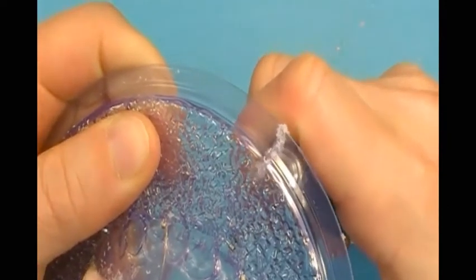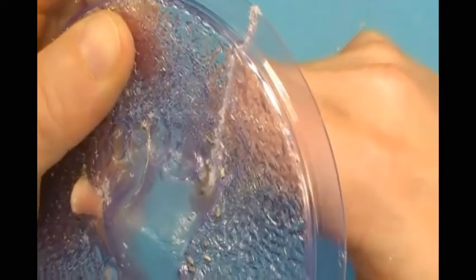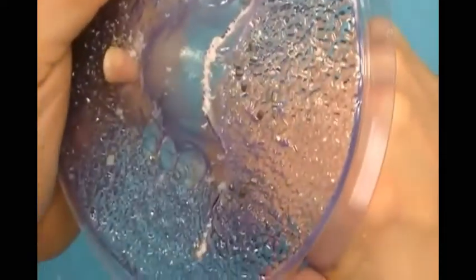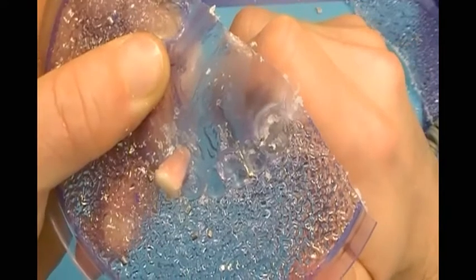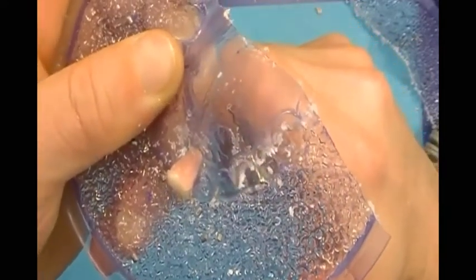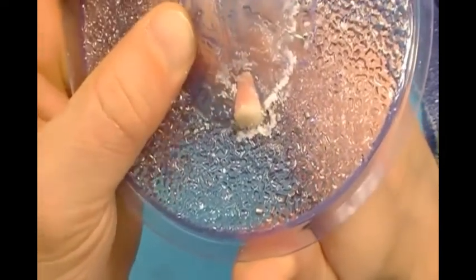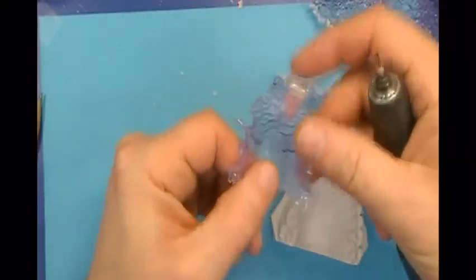Using a carbide cutting bur and lab handpiece, cut out the retainer from the disc. Start by cutting along the back of the appliance at the first or second molar reference. Then cut along the lingual cusps of the posterior teeth and near the incisal edges of the anteriors. Caution must be used around wires that are embedded in plastic. At the pontic, cut around the facial side of the tooth surface. Once the cut has been made in the plastic, remove the retainer from the disc.